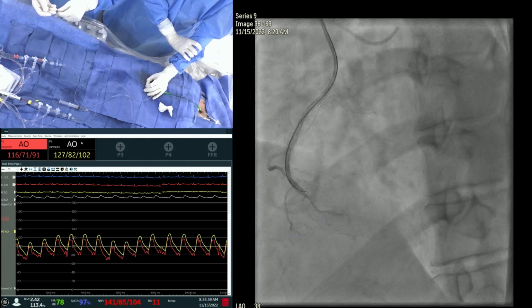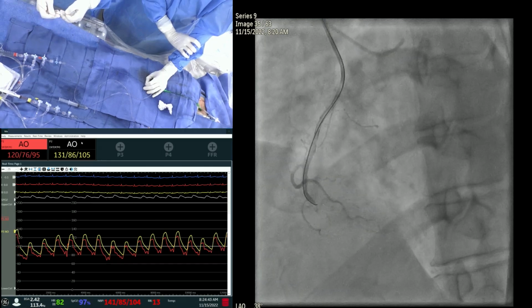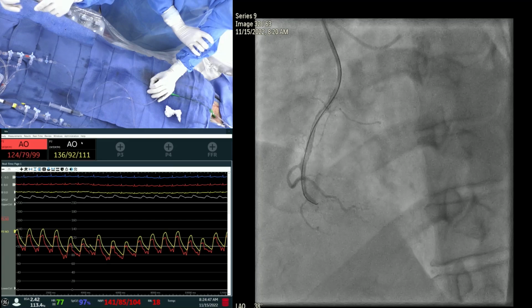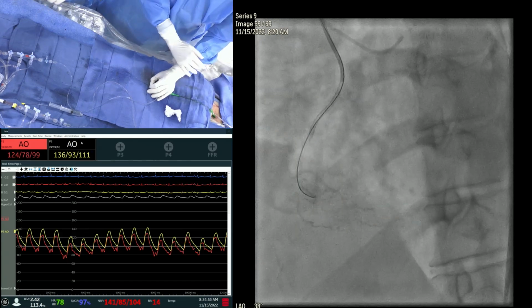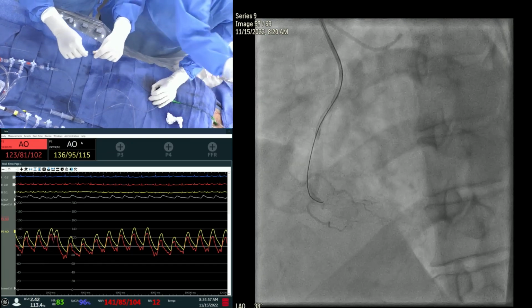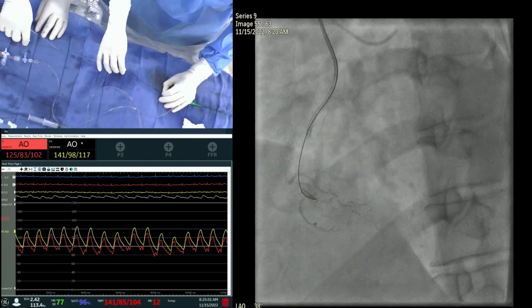That wire initially was going to the small branch. Since we have the tapered proximal cap, it was very important. See how the wire was facing. I took the cine, you can see that. After this, we were able to navigate through that CTO. It's a very important point.